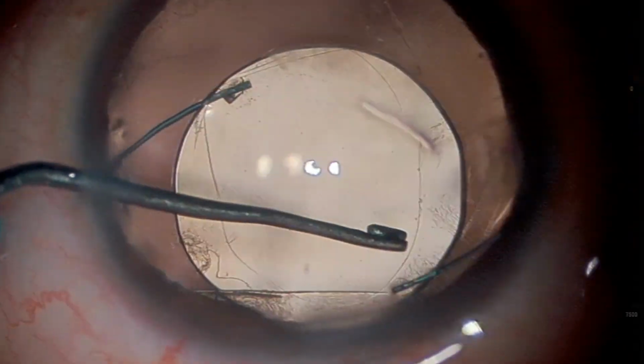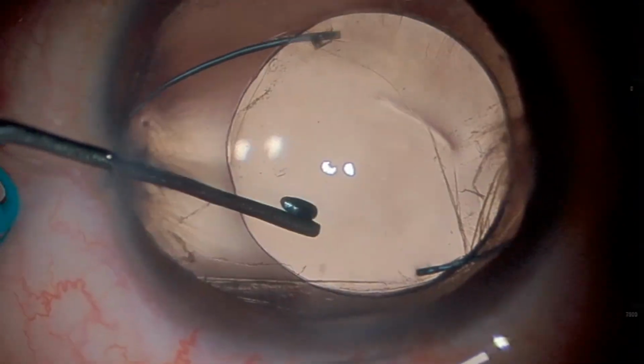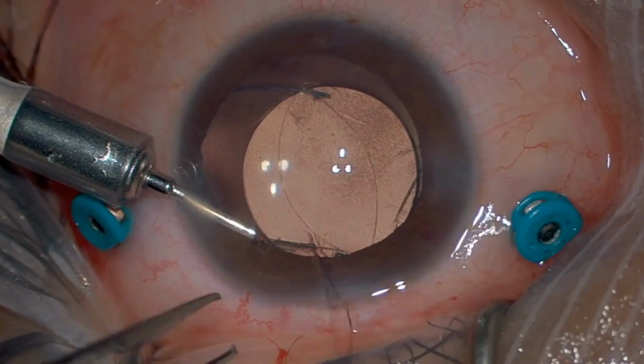A 3-piece IOL is then placed in the sulcus and the optic is captured through the posterior capsulorhexis. Finally, cryo is applied to the retinal breaks. This is the end of the surgery and the lens appears well centered.